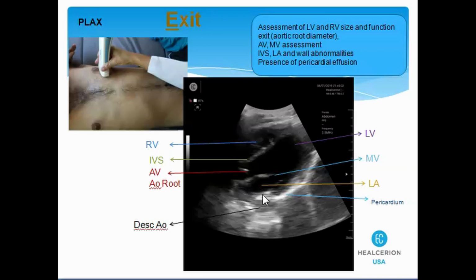If you look at over here, the bright line is the pericardium, and this is the left ventricle inferior wall. Above that you will see this black area, hypoechoic area, because everything which is fluid looks anechoic on the ultrasound, just for your recall.